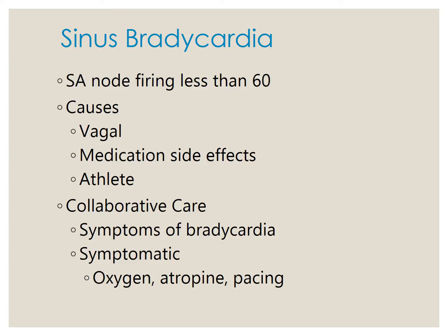Sinus bradycardia. This is when the sinus node is firing regularly at a rate less than 60 beats per minute. Possible causes can be an increased vagal tone, if somebody is vomiting, or carotid sinus massage. A big one that we see is when someone bears down during a BM because they're doing that Valsalva maneuver, which is increasing that vagal tone.